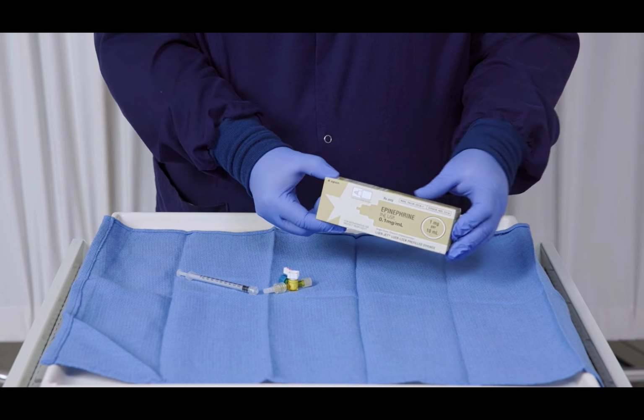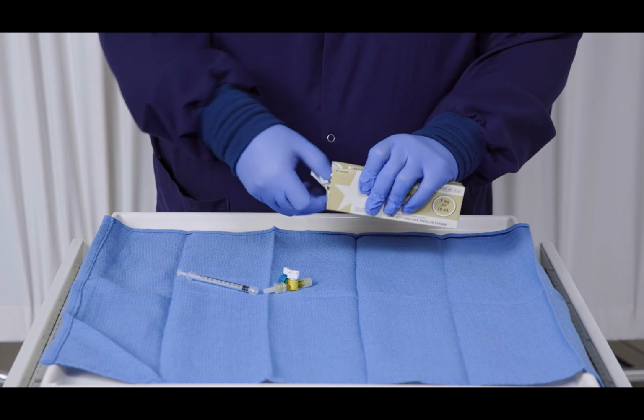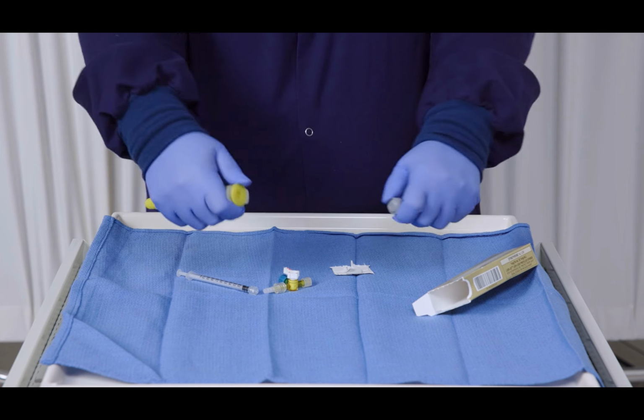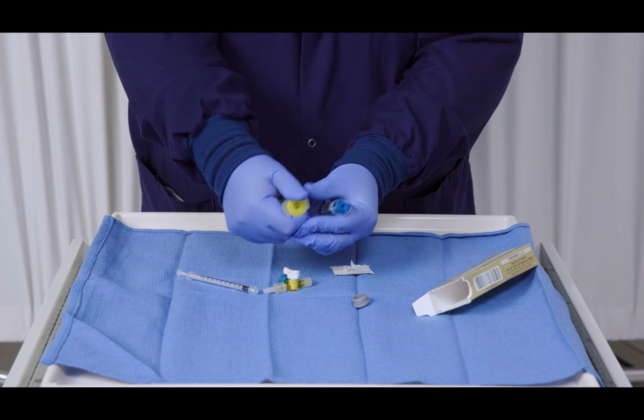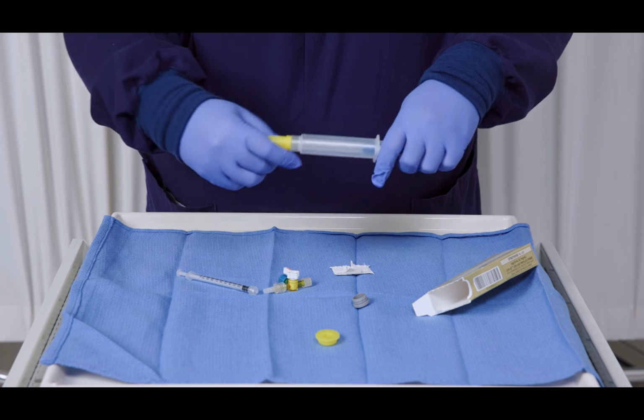The correct epinephrine usually comes in a box. Open the perforated end of the box. Remove the 2 pieces inside. Holding the devices with the yellow caps on top, flip off the yellow caps and screw the 2 pieces together.